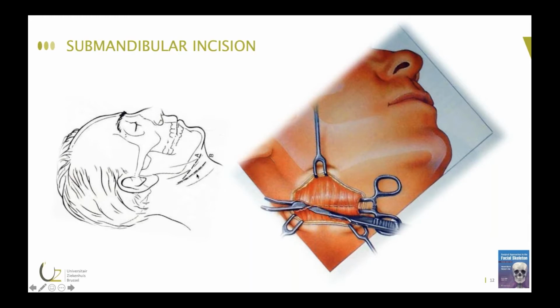The lower the better in relationship to the marginal branch of the facial nerve and for access to the external carotid artery in case it needs to be ligated. The more cephalad though, the easier to insert the mandibular component and insert the osteosynthesis screws. One has to outweigh advantages and disadvantages and decide. As for the length of the incision, one can always start short, like 3 cm, and pending elasticity of the soft tissues, extend anteriorly.